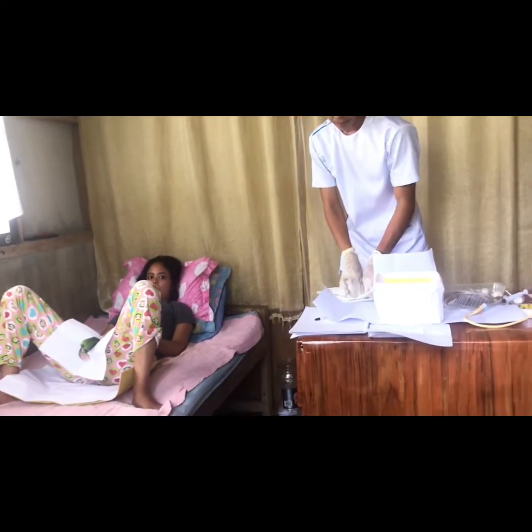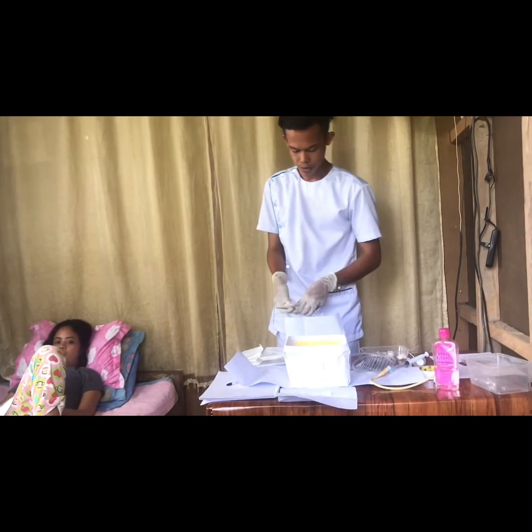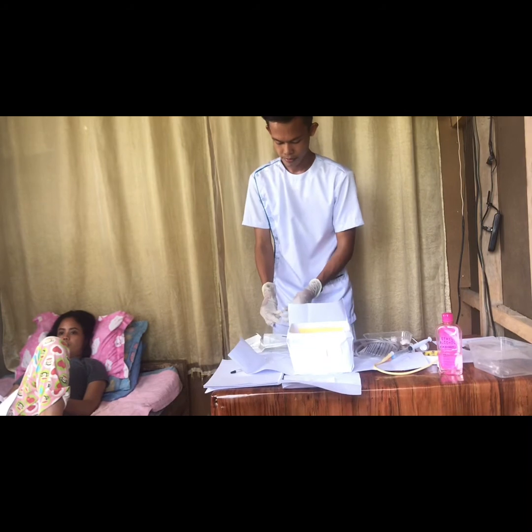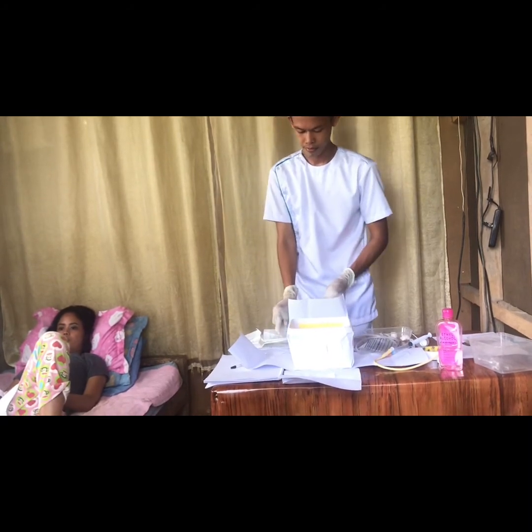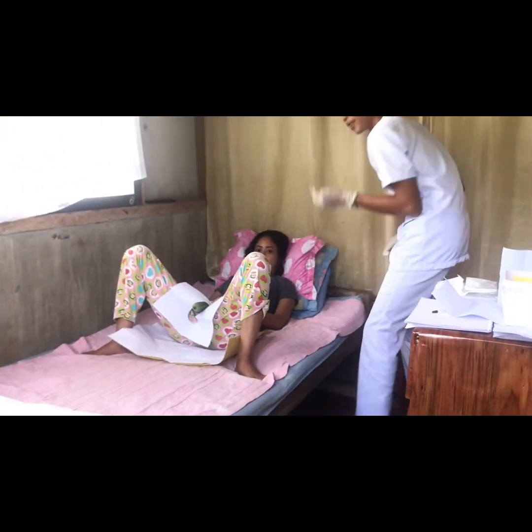And then we're going to dispose of it immediately. Same thing, we're going to use an alcohol swab to clean the surface of the patient. Dispose.